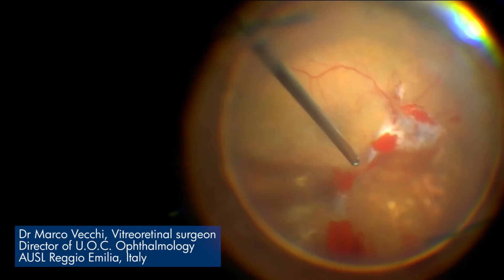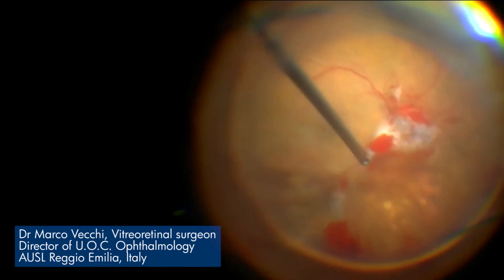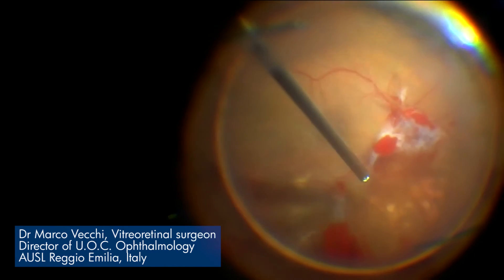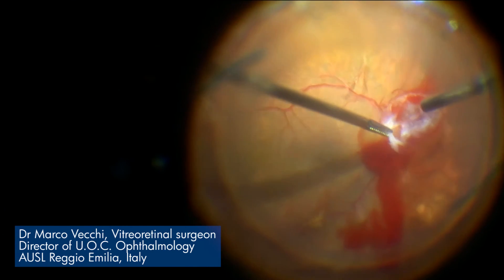The speed in removing the vitreous is unbelievable. For the first time, in less than one minute you can perform a complete vitrectomy. You can adjust the number of cuts and the smoothness of the aspiration, achieving perfect stability and stillness of the retina in giant retinal tears or in diabetic retinopathy, which is far more important in difficult cases.